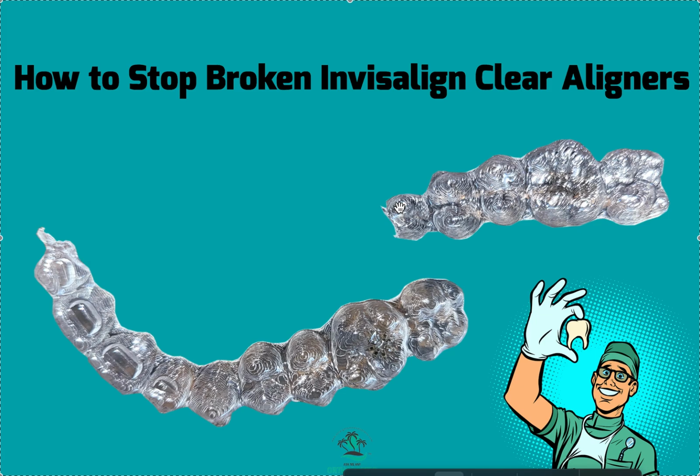So definitely should have a plan for when this type of stuff happens, which is why I like to say, please keep your old aligners. You don't have to keep them going back 30 aligners, but at least keep the most recent 3, 4, 5. I love the idea of giving your patients a tackle box that's labeled for them to save their aligners in. Don't put it back in the nasty bags because they get moldy.